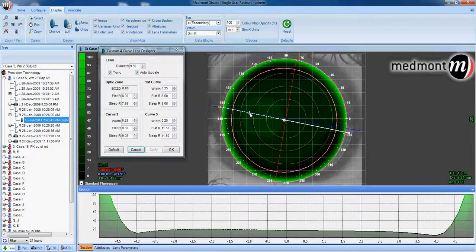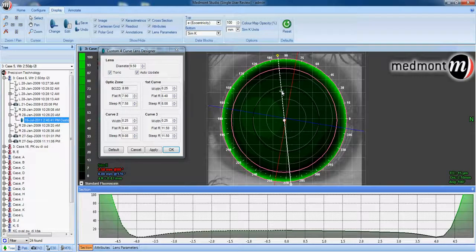Presently, our contact lens is not landing across the horizontal meridian. The horizontal meridian you can also see is our flat meridian by that blue line. So let's steepen the base curve along the flat meridian by a half diopter step. On the vertical meridian, we appear to be very near to bearing or definite bearing at 12 and 6.